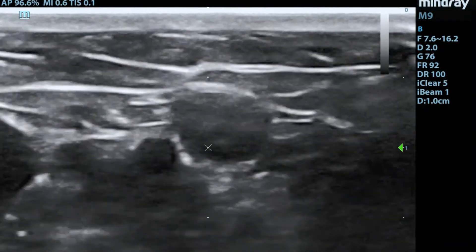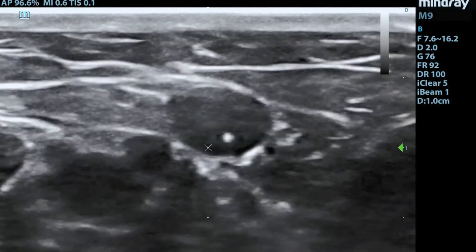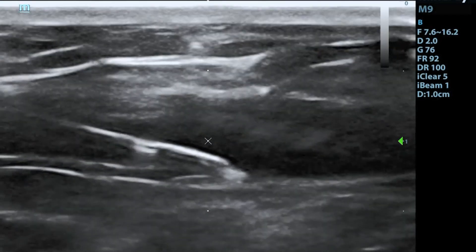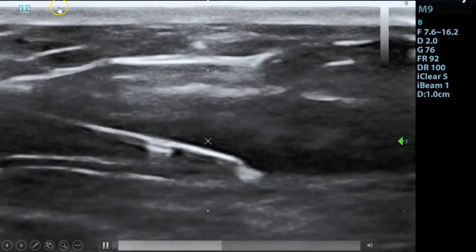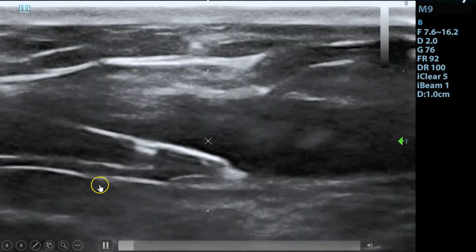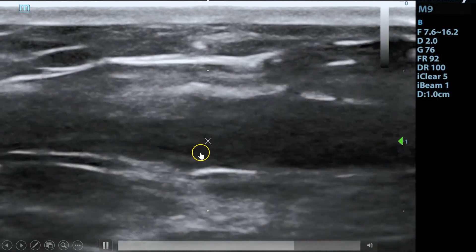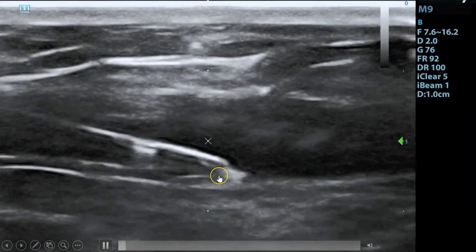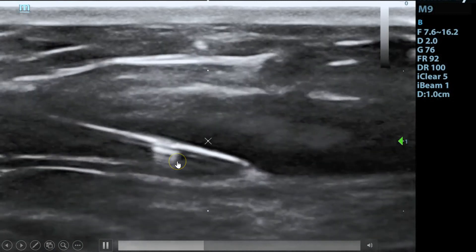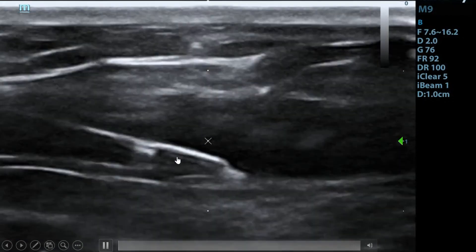At this point, she's hubbed. One of the things I like to do — and have been teaching a lot of people to do — is to confirm in long axis. You see the skin and subcutaneous tissue, you see the vessel, and then you see the catheter in there with this bright white line. That was the needle. Then right around there you see the needle being retracted as everything moves, and then there's just a catheter left.